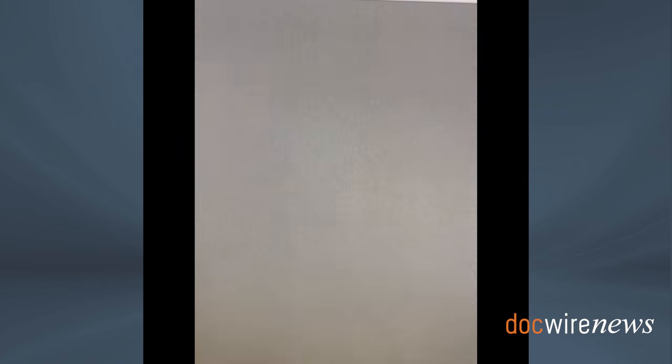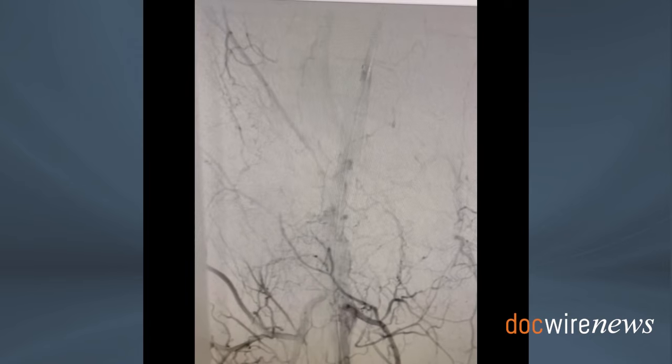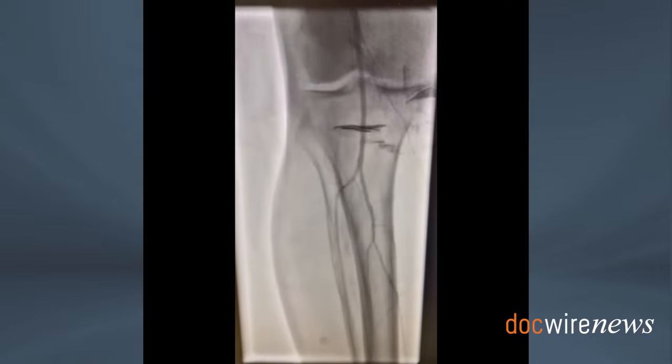This led to the complete resolution of the pseudoaneurysm, confirmed by angiogram, and a follow-up runoff angiography confirmed the absence of embolization.